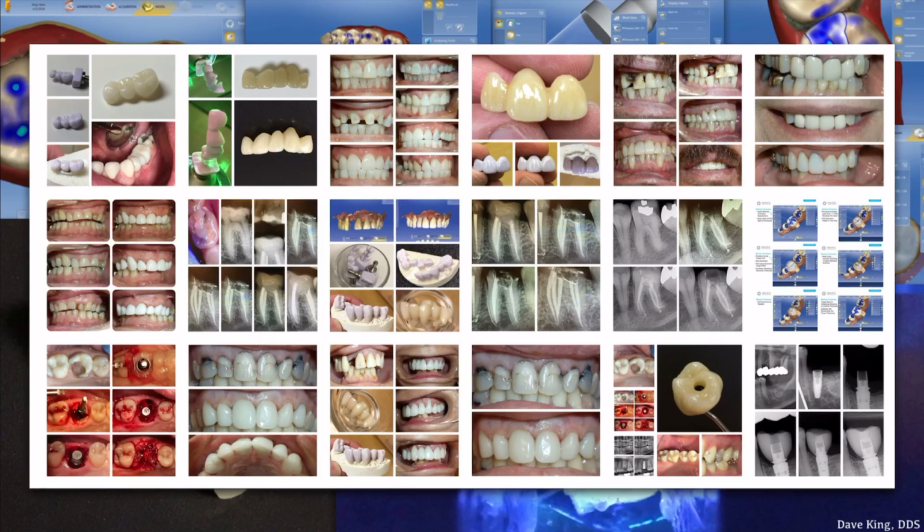Down here we've got, halfway through, 10 crowns. This is BL1, the whitest shade that I was comfortable going. There's a little bit lighter shade, but that's BL1 and Emax. Done in one sitting. That was about 4 hours for 10 crowns. You can see his previous setup here. He wanted to open his bite, so we opened him a little bit. The plan was to do the lower teeth at a later date once he recovered from the uppers.